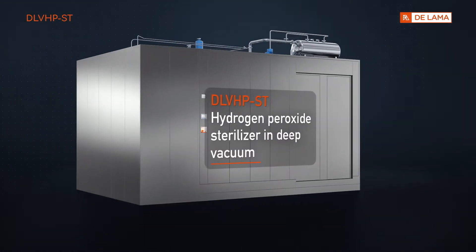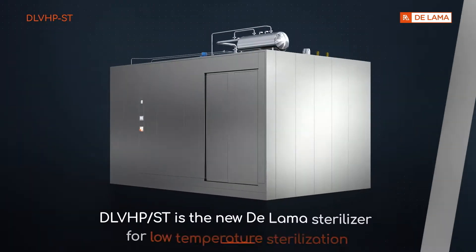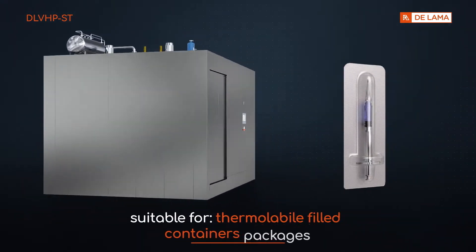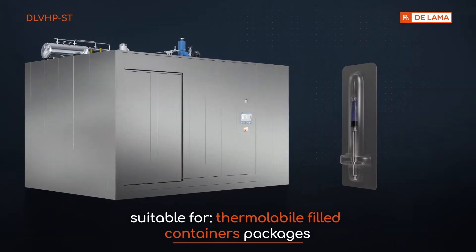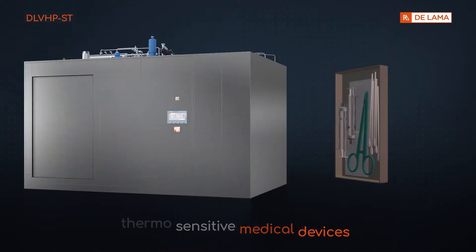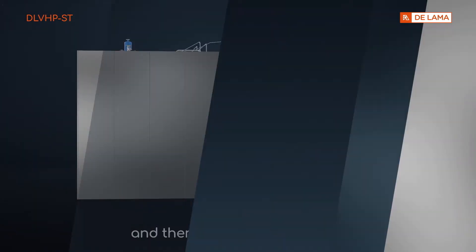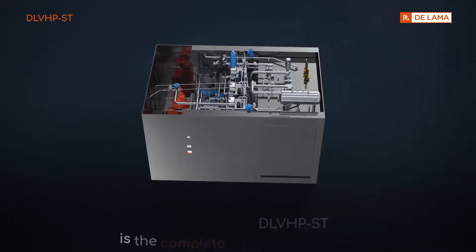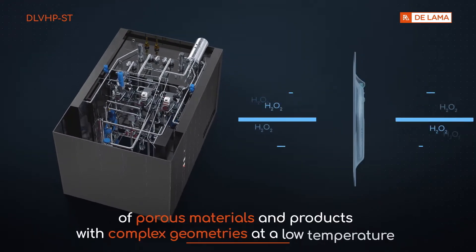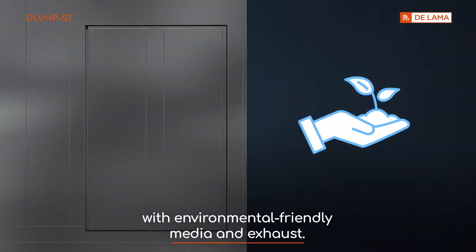Hydrogen Peroxide Sterilizer in Deep Vacuum. DLV-HP-ST is the new DALAMA sterilizer for low-temperature sterilization, suitable for thermolabile filled container packages, thermosensitive medical devices, and thermosensitive implants. The revolutionary concept introduced with DLV-HP-ST is the complete sterilization of porous materials and products with complex geometries at a low temperature, with environmentally friendly media and exhaust.